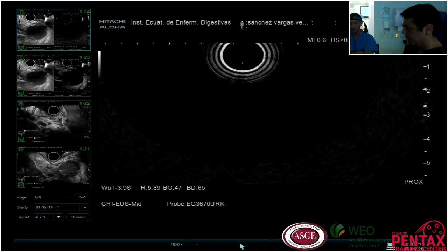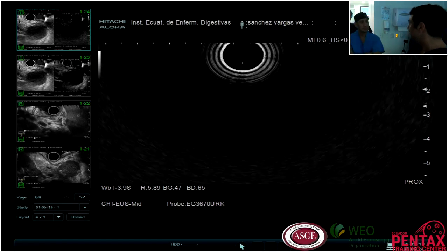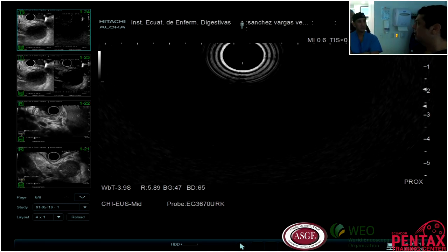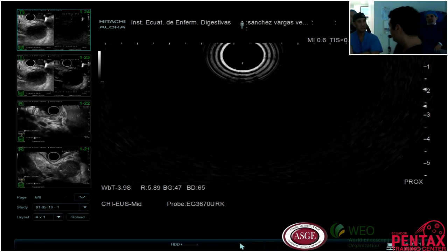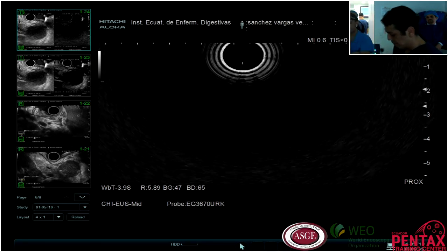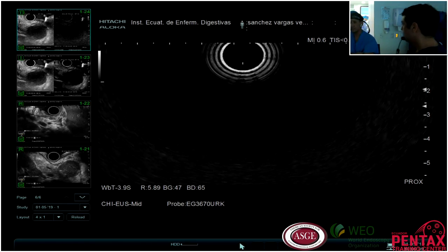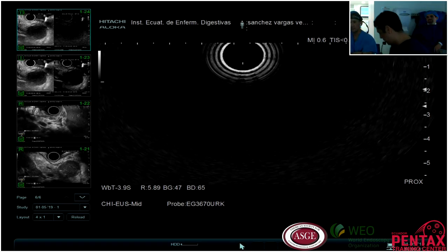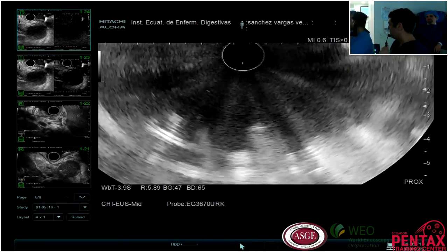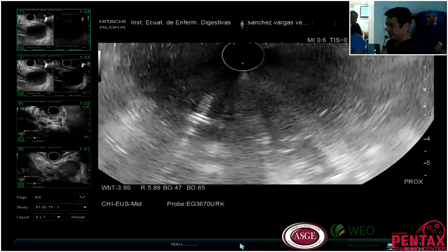So I think there are some septum inside. It's very mixed, a difficult case. I think there are some areas that are confusing regarding this case, regarding the evaluation of the morphology of the pancreas. So it's a very nice case.